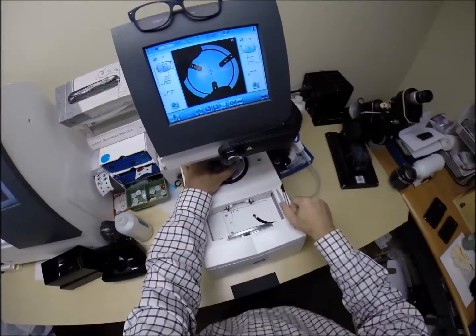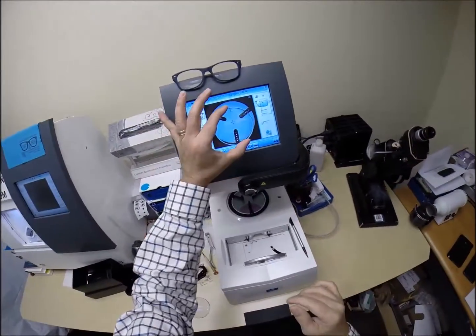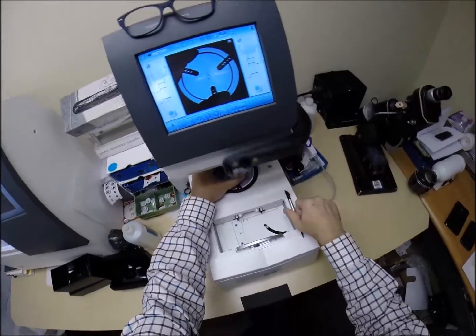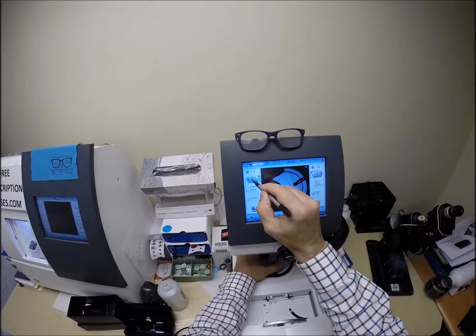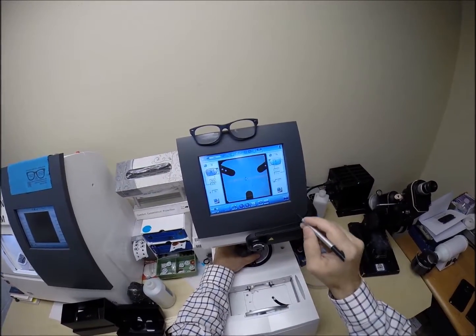We are good. Now if these were prescription, I would put 3 dots for my lensometer, make sure it's lined up in there perfectly. But being non-prescription, it really does not matter. So I'm going to hit this button. The arm's going to come down, place the block onto, that Crizal Sapphire is so smooth, so slick. Didn't want to do it. Let's go back over here to the right and let's try this again.